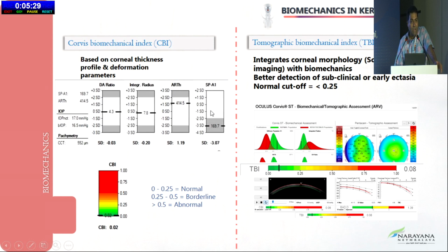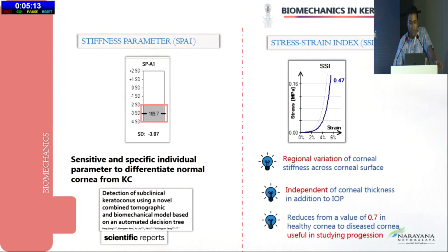Anything above 100 is considered normal strength because this is not heavily dependent on your corneal thickness, intraocular pressures, and multiple other hydration parameters. All the other things here are heavily dependent on your IOPs. If IOP is high, everything is falsely low or falsely high.